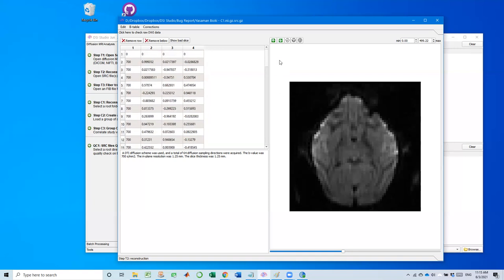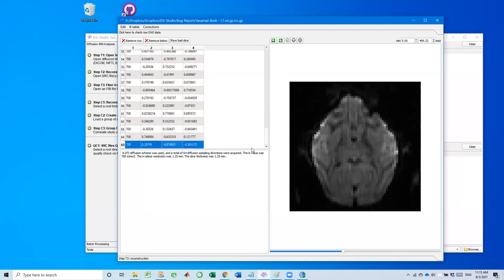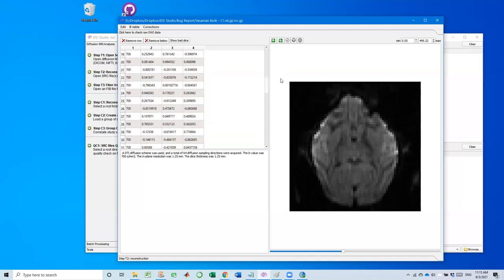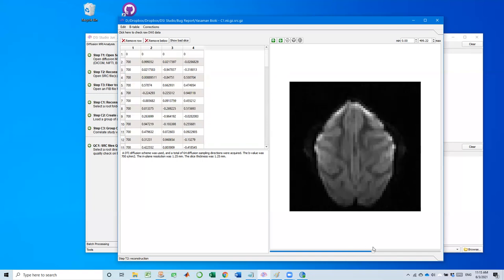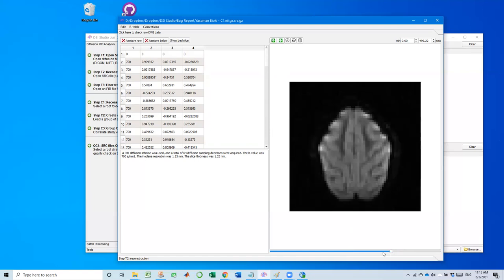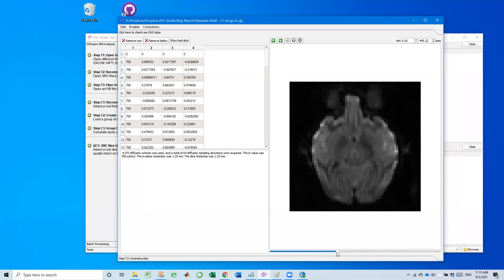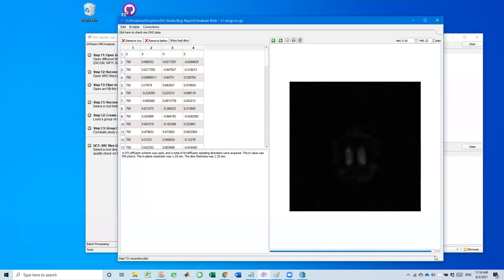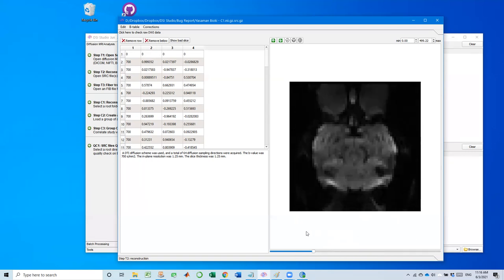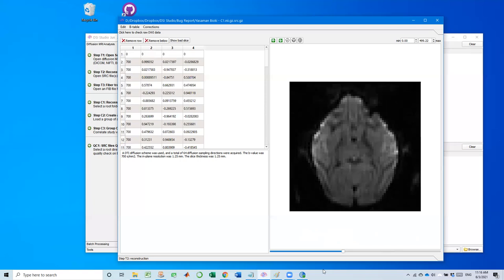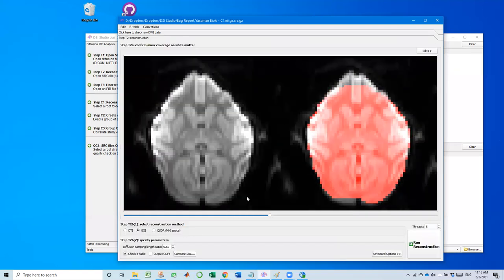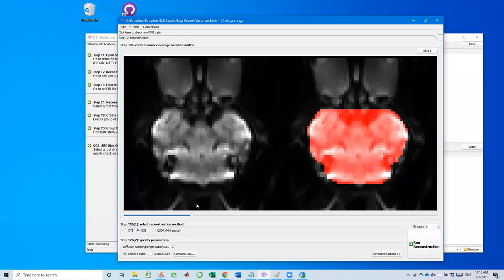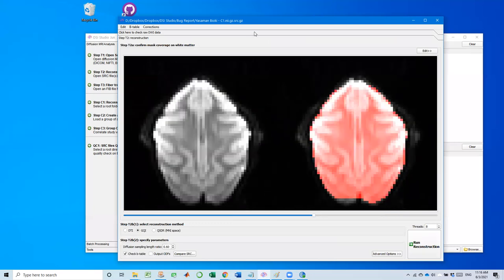And the eddy current, this kind of brain movement, it's about one or one voxel distance. It should be still okay, it's not that serious. So we'll still go ahead. But just in case to note here, if we do get the perfect data set, this still needs to be processed by FSL. And FSL eddy topup will output NIfTI file, then we can load it back into DSI Studio to continue the analysis. So in terms of its data quality, it's decent. I would say it's like a nice data set.